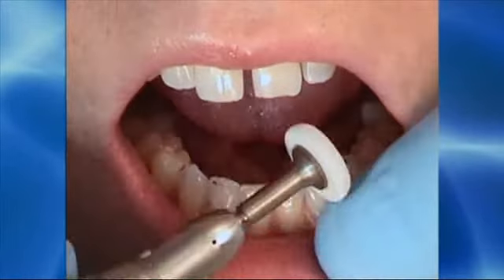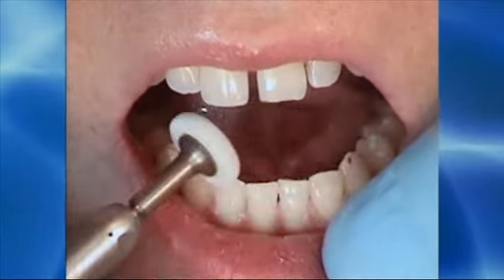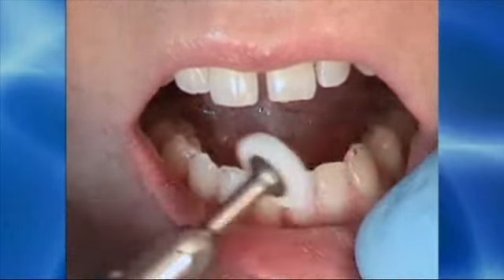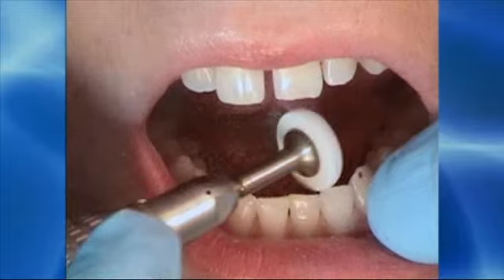And then for patient comfort, it's important to polish the incisal edges and smooth away any graininess. And these rubber wheels do an excellent job of smoothing enamel or porcelain. You can see I'm lightly dusting the edges and polishing back towards the incisal.